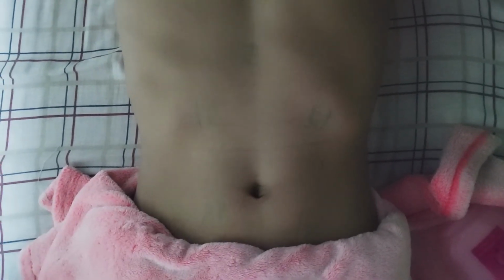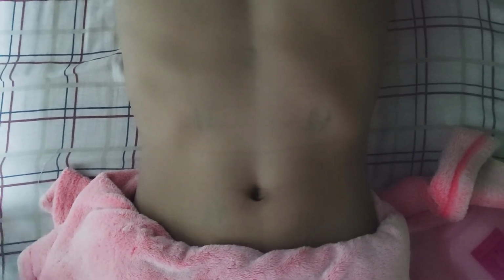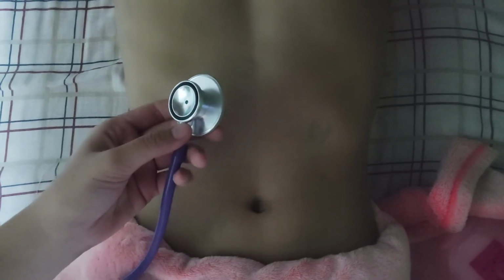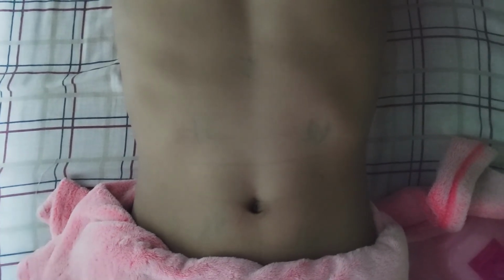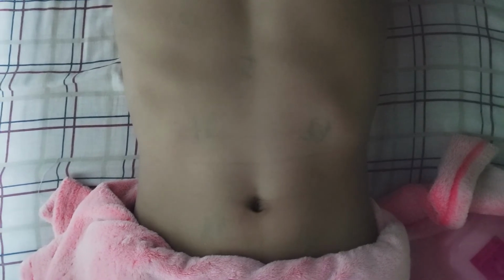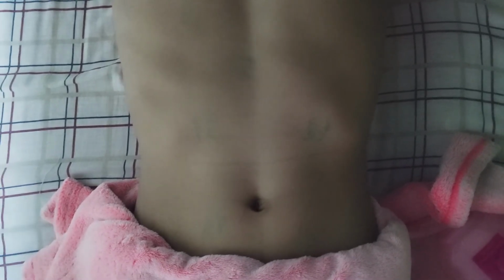So after listening to the bowel sounds, then we're going to listen to vascular sounds and do this at the bell of your stethoscope. And we're gonna listen to aortic, renal artery, iliac artery, and you could also listen to femoral artery if you need it. So let's listen to aorta artery, and it's a little bit lower on the xiphoid process and a little bit above the umbilicus, and we were listening to blowing and swishing sound that would represent a bruit.